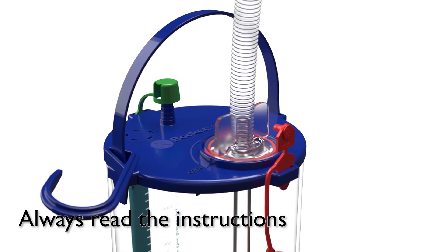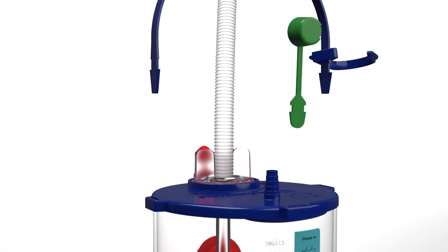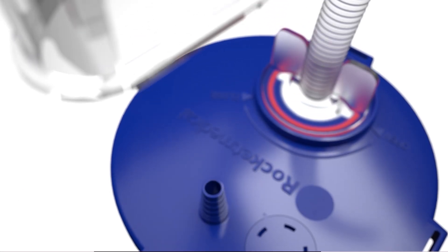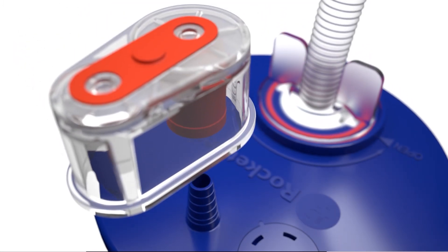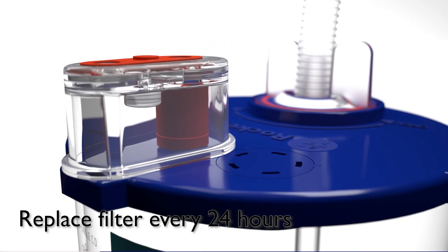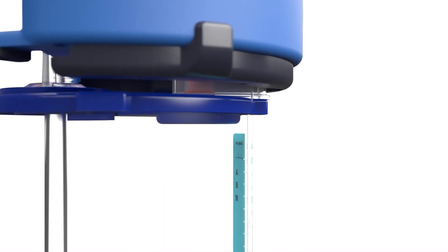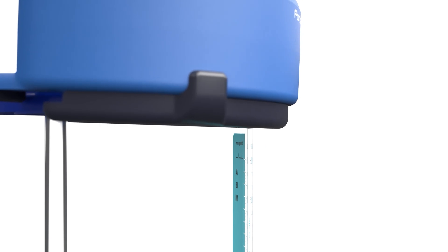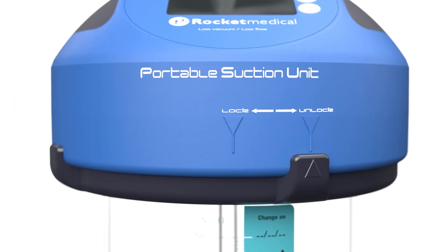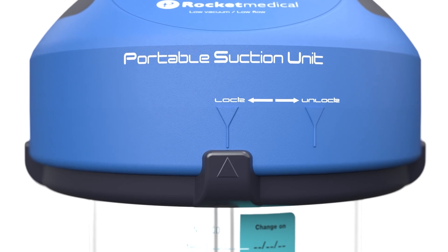Prime and set up the chest drain bottle as normal. Then remove the handle, hook and green dust cap. Place the R54571 PSU filter over the exhaust port and place the location peg into the correct aperture. Place the PSU over the filter so that the filter fits into the filter recess under the PSU. With slight forward pressure, rotate the locking ring anti-clockwise until it locks into position.